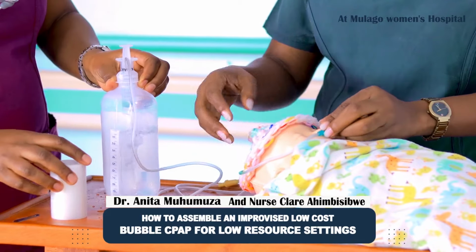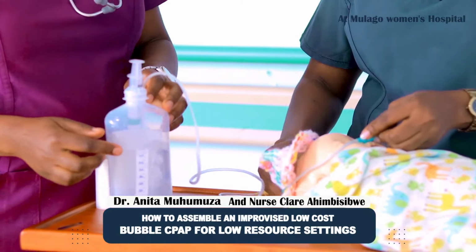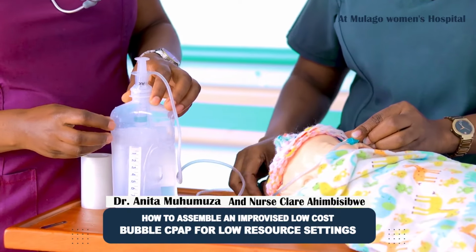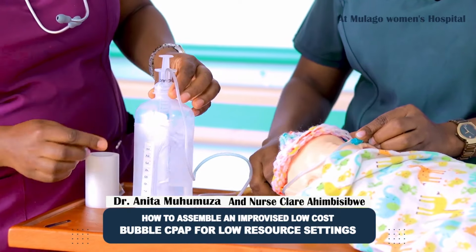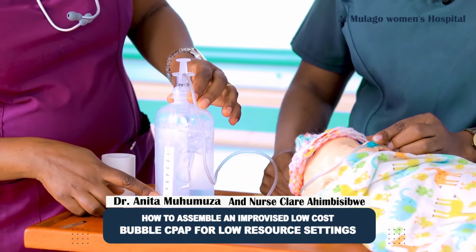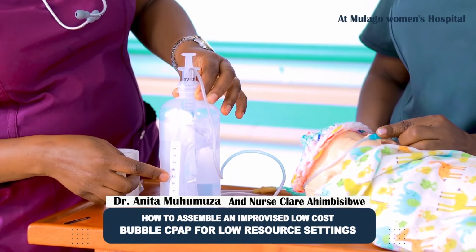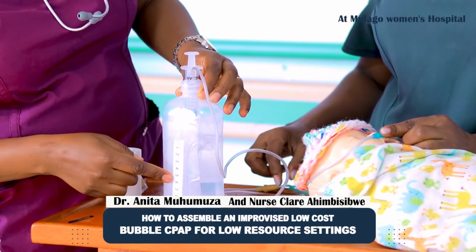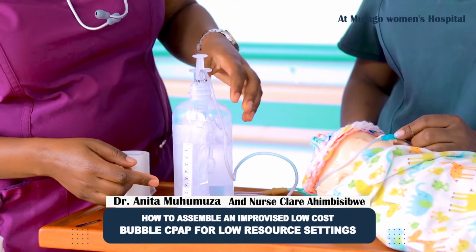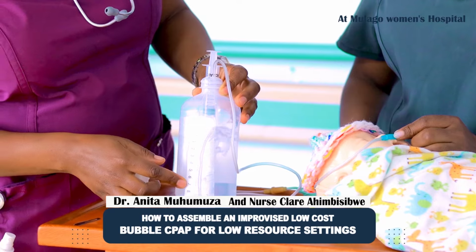So this is how you know that your bubble CPAP is working. The prongs should be fitting snugly in the baby's nostrils, not too tight and not too loose, and you should have bubbles, as you can see. So this shows that your system is working. What we are doing now is providing the PEEP, the positive end expiratory pressure. We have set it at 5 for this baby. This is a full-term baby. If this was a preterm, maybe we would need a PEEP of like 6 or 7.